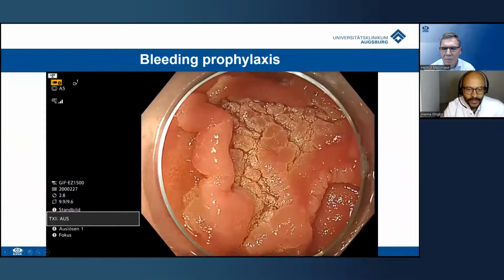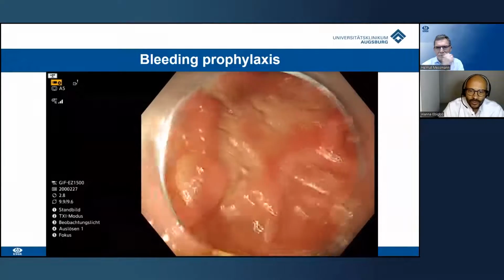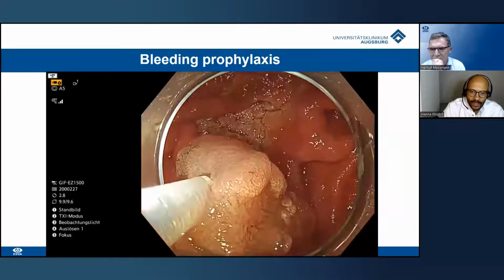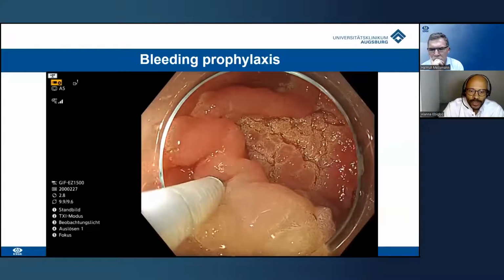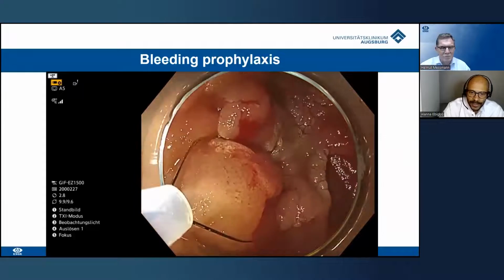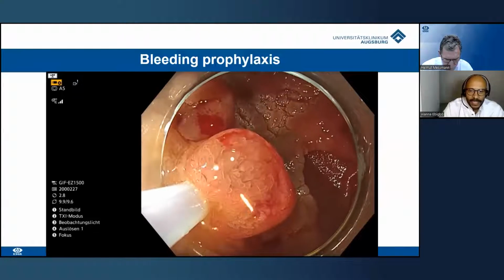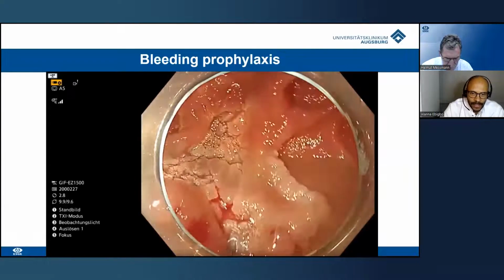Yes, thank you. Good evening, ladies and gentlemen. One possible strategy to approach the issue of post-polypectomy bleeding or delayed bleeding could be not just a multimodal approach using clips, coagrasper, but also adding a topical agent such as Hemospray or Nexpowder.